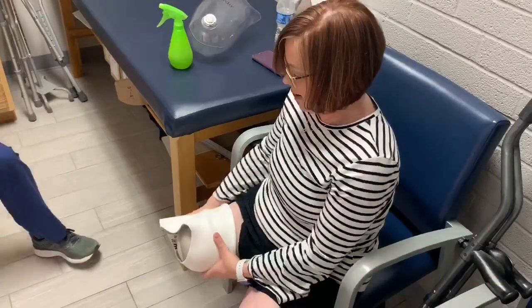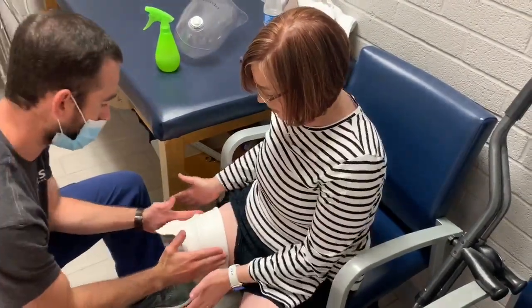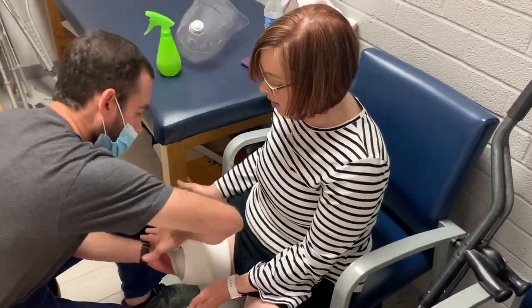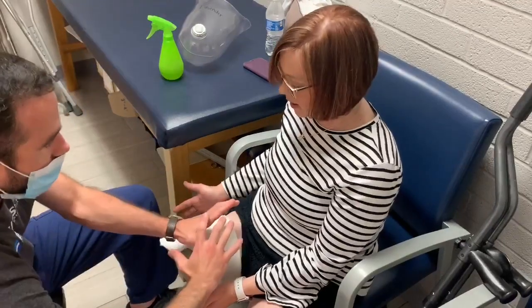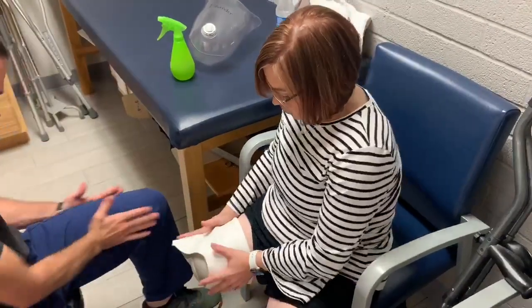So when you're getting it on, everything's looking great. Try to keep your pulls in a straight direction. Sometimes you try to pull and end up throwing your elbow into it, and you get a directional pull onto it. It's just going to pull your skin a little bit more. So just try to keep it straight.